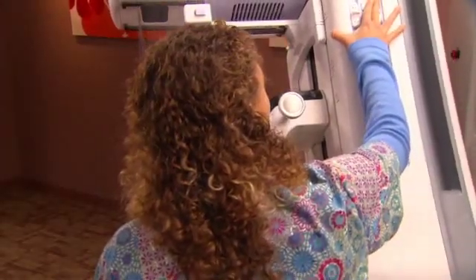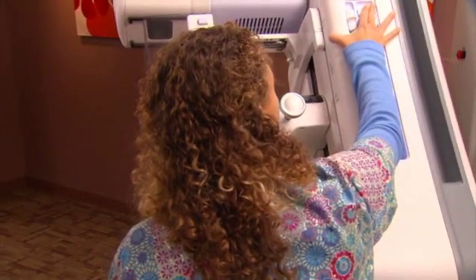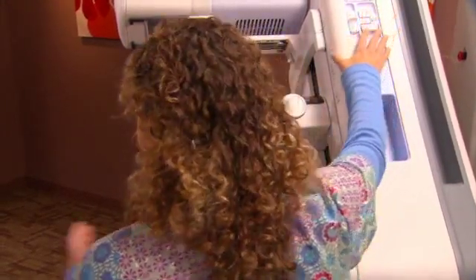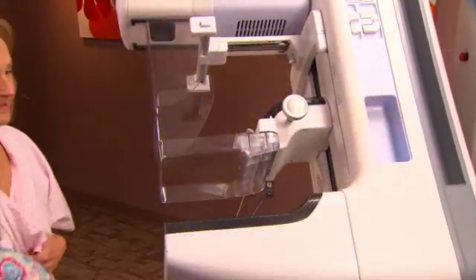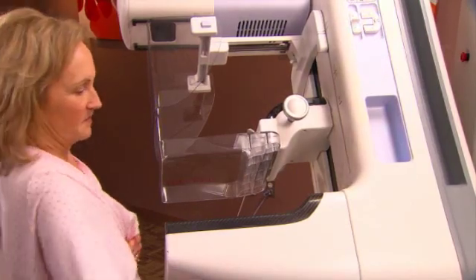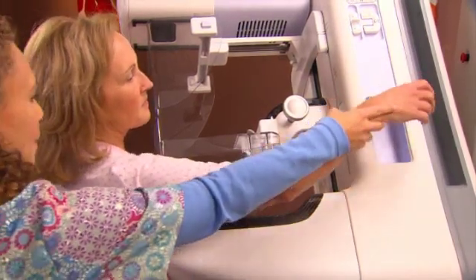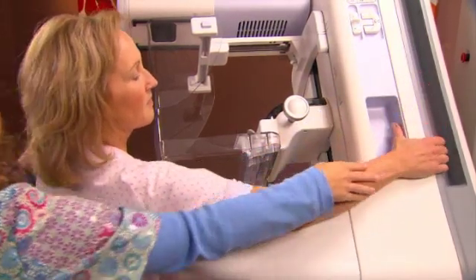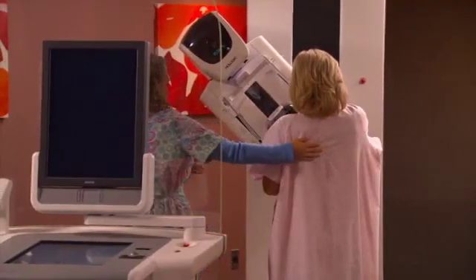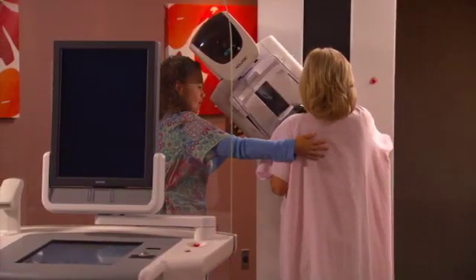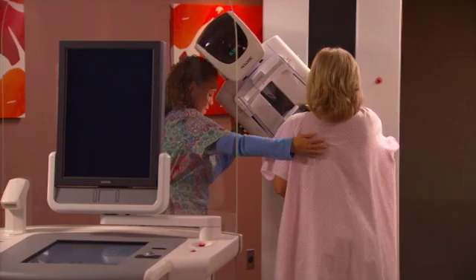The gantry and C-arm are sensitively designed, with ergonomic features that maximize ease of use for the mammographer and minimize discomfort for the patient.